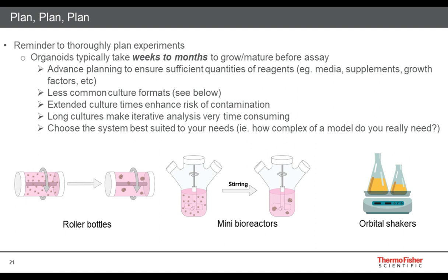They would grow on the order of days to maybe a week or two, depending on what model system you're using and how large you're trying to have it grow to. But typically in the organoid space, protocols last anywhere from several weeks to potentially many months before they're at an endpoint where they're useful for assaying.